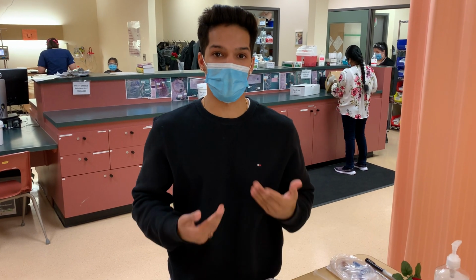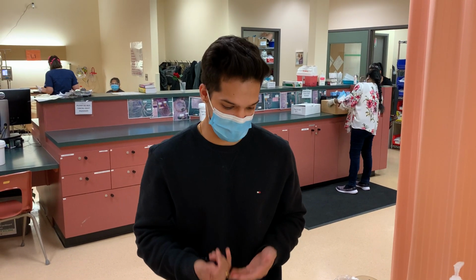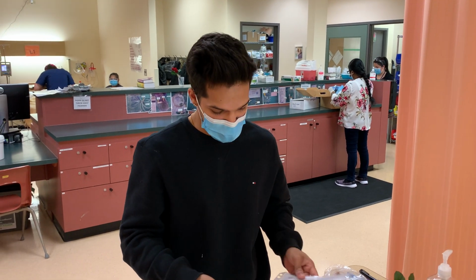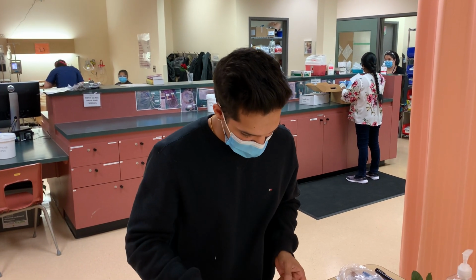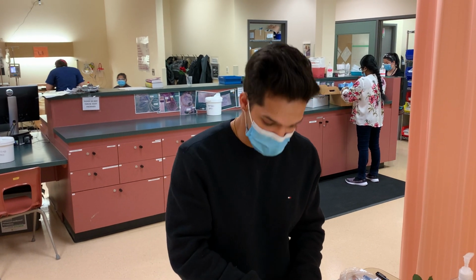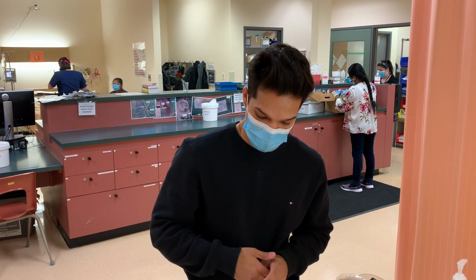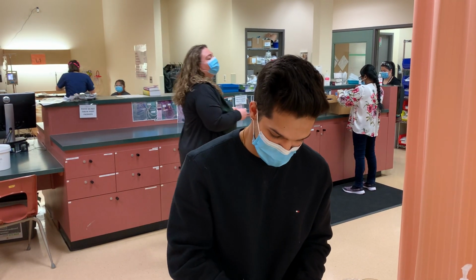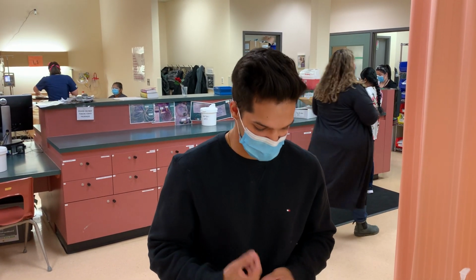I have D50W available on the unit in case the patient experiences hypoglycemia. That's readily available on the unit, so that's good. And then I'm going over to the insulin continuous section, IV continuous, 1 to 10 units per hour. That means we're clearly in the safe range. We're running it at 2 units per hour continuous, and this is highly individualized based on the blood glucose levels.